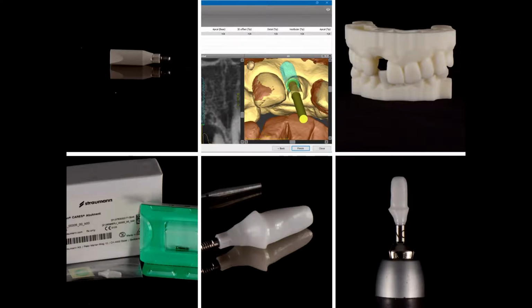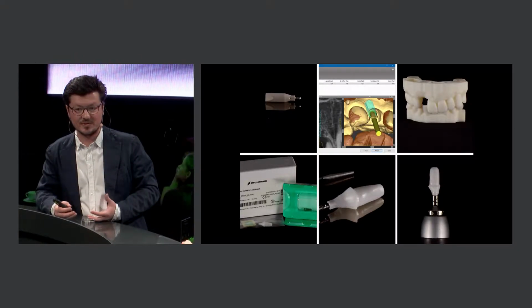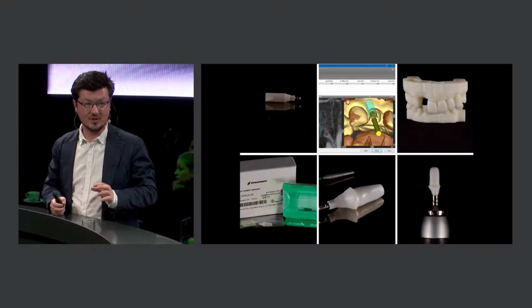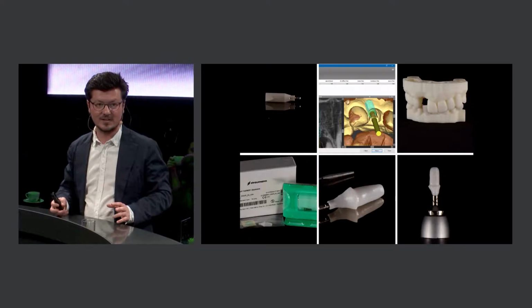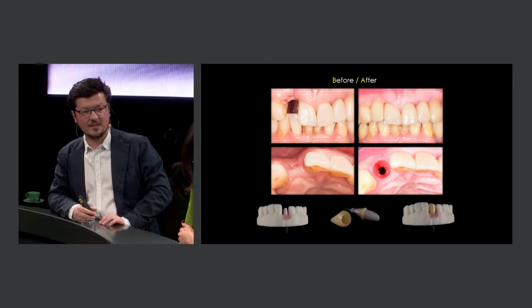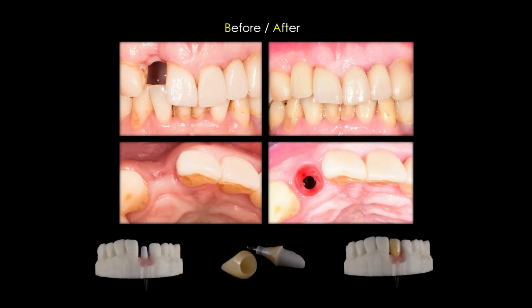Then the technician created this CARES zirconium abutment. We chose it for better aesthetics, and it could better repeat the soft tissue contours of the restoration that we created. He's printing the models. The models can be exported only from CARES Visual, so the digital implant analog fits perfectly, otherwise it's not feasible. And this is the final result. We made a lithium disilicate crown on this abutment. You see, we even managed to print the gingiva on the model, and you can see a better result in this complex soft tissue case. It was very difficult, but at least we have some improvement.